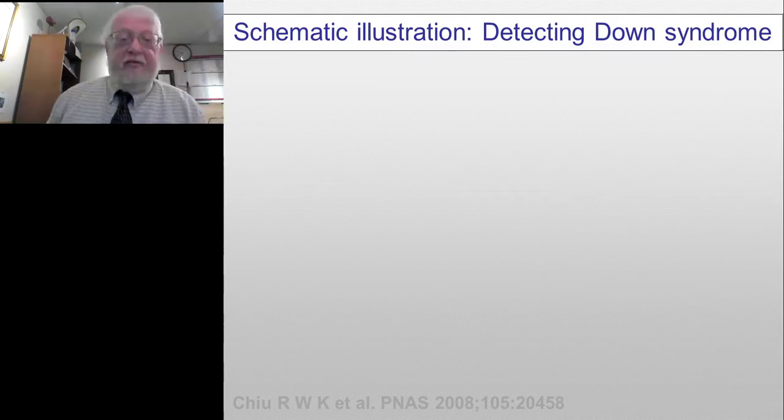Why don't you sequence 15? It would be faster, wouldn't it? Well, if you sequenced only 15, there would be a lot of matches, and they wouldn't be unique. And you say, well, then why don't you sequence 60? And the answer is, well, then you're using up a lot of additional sequencing and expense, and it really doesn't get much better. So could you do 34? Sure. Could you do 41? Sure. So there's no magic to 36, but the point of the sequence is to try and uniquely describe that fragment to a chromosome. Then the next step is simply bean counting.